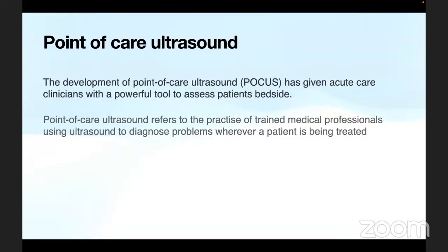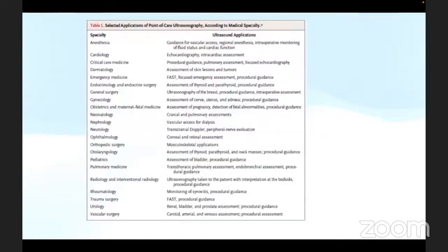The development of point of care ultrasound has given acute care clinicians a powerful tool to assess patients at the bedside. It helps us in determining the diagnosis and providing interventions at the same time, and correcting our therapeutic goals in real time instead of waiting. And point of care ultrasound has infiltrated into almost all specialties of medicine and patient care.